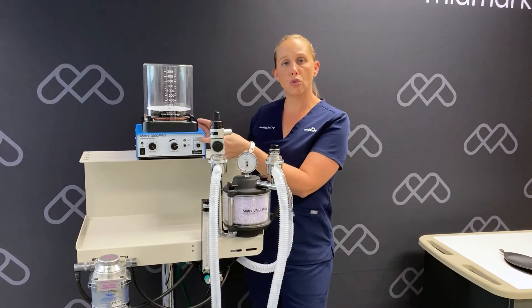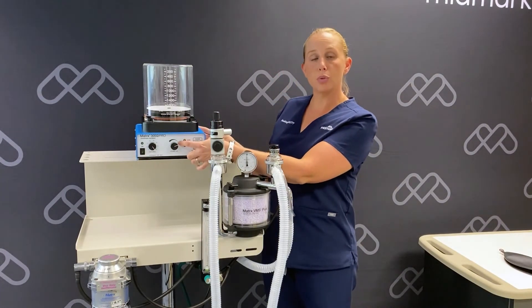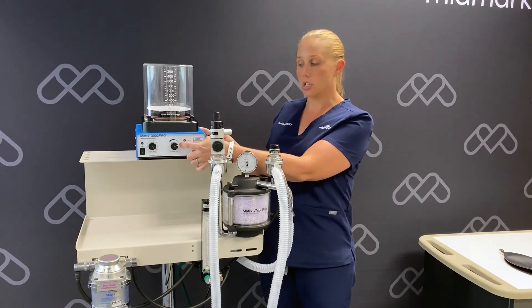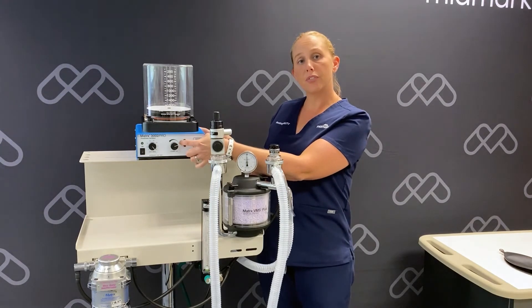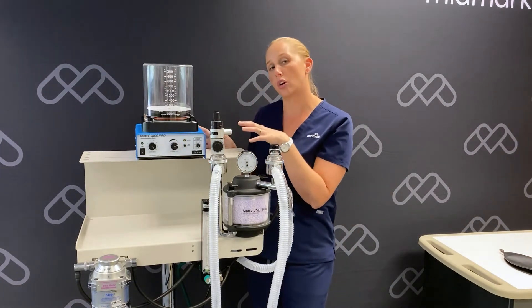Now we'll review the controls of your ventilator. The volume control is what is used to set the amount of ventilation and adjust the minute ventilation of our patients. The adjustments are finer increments for lower tidal volumes and coarser for larger tidal volumes.